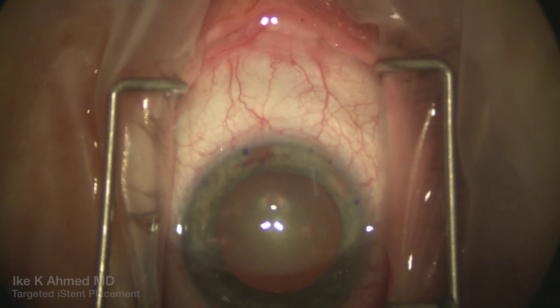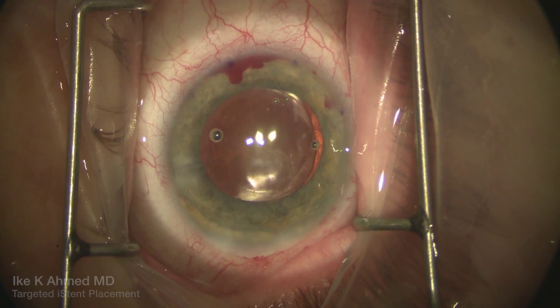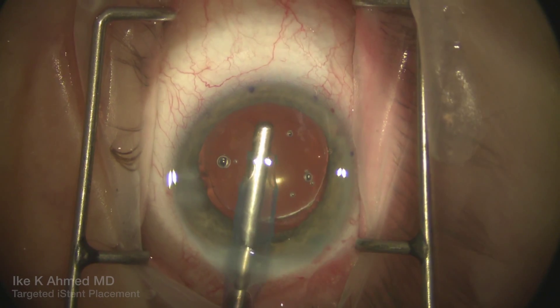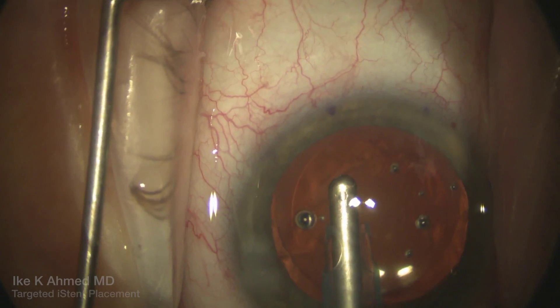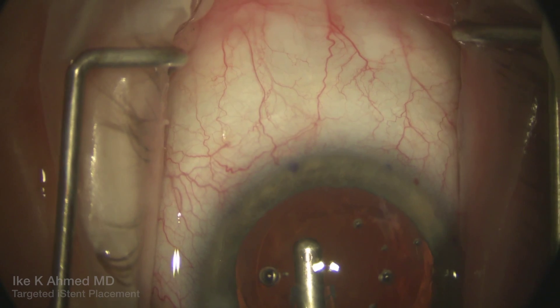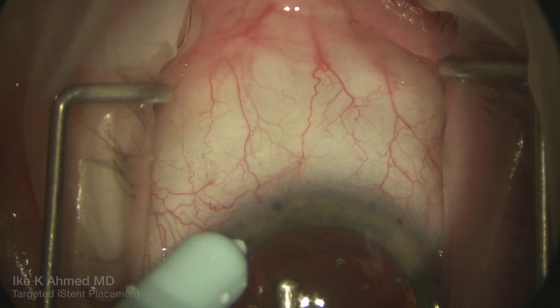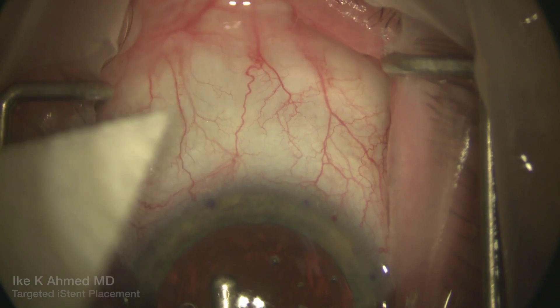We will then proceed with phacoemulsification. After the phaco and IOL placement has been performed, the pressure is lowered in the eye and we evacuate the viscoelastic using the irrigation/aspiration handpiece. We'll see significant blanching in the area nasally and infranasally, in the vicinity of the iStent which is placed where that ink mark is.